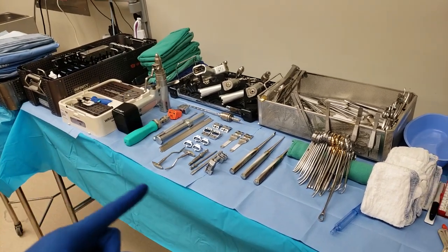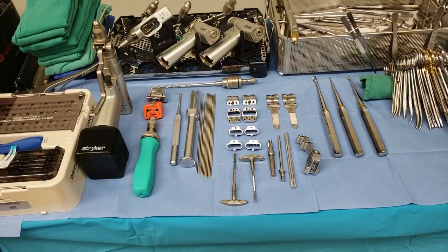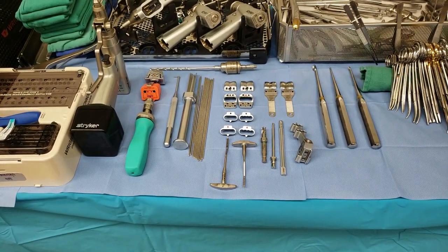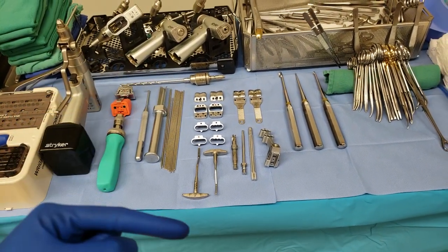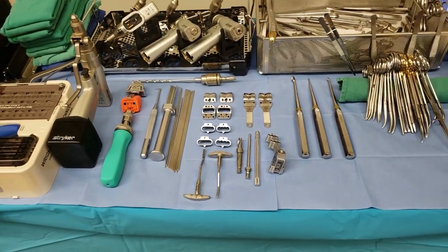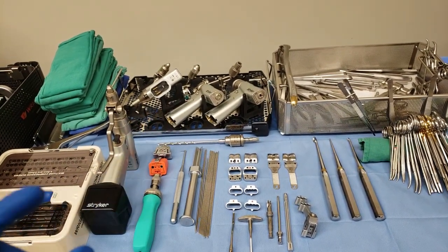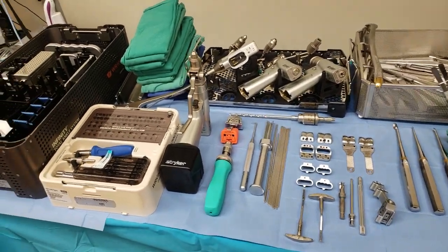So everything in the rep trays here, I don't know the name, so I just kind of rearranged it with him and see what the surgeon wants and will use. As you can see, he got some trials over here, 1 and 2, that matches with the other trials, 1 and 2. That's our drill set. I'm kind of excited that they put this tray over here to organize them instead of just being all messed up in a tray. It's kind of exciting for me.